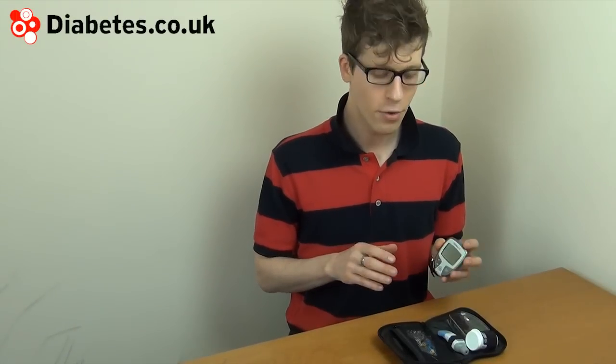Before I do a test, I'll tell you about the basic and advanced settings which the meter has. If you use a meter straight from the box you'll get the basic settings. This allows you to do your blood test, view the results, and view basic averages — great for a beginner. If you wish, you can switch to the advanced settings, which allow you to set pre and post meal markers, letting you view averages from before and after meal testing.